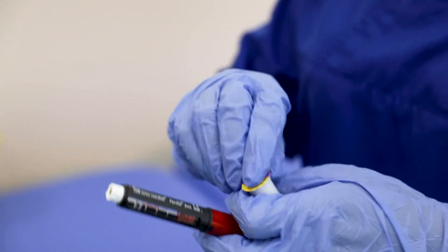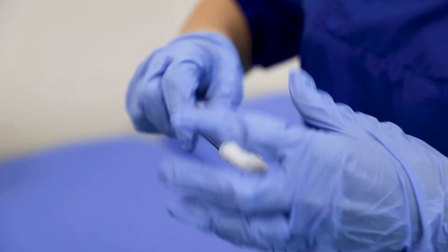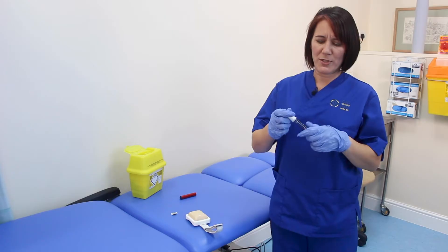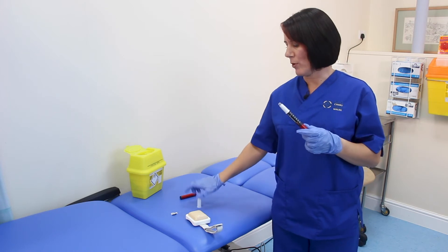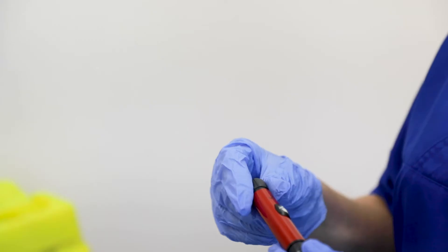Take the cap off the pen and take the top off the safety needle. Screw the safety needle onto the pen just until you feel resistance — don't over-tighten it. Then pull the cap off your needle. You need to always dial up an air shot — dial up roughly two units.